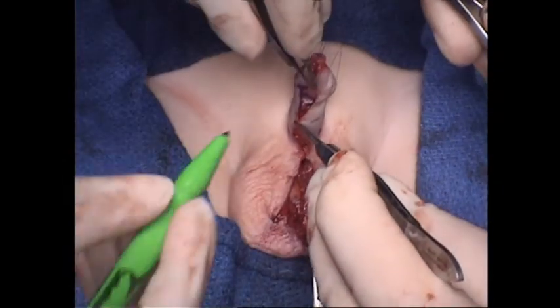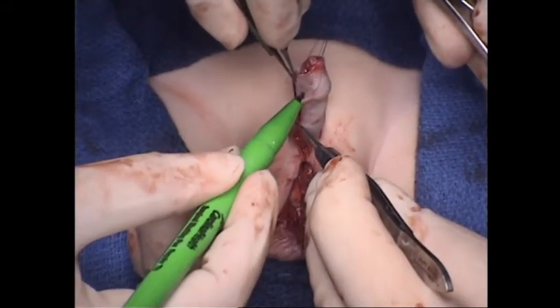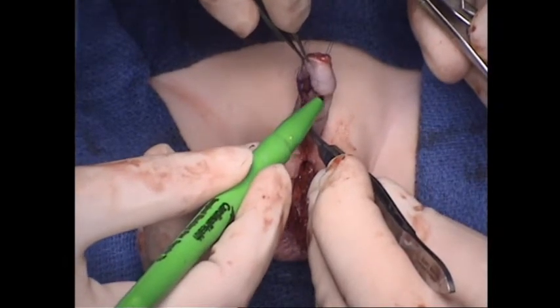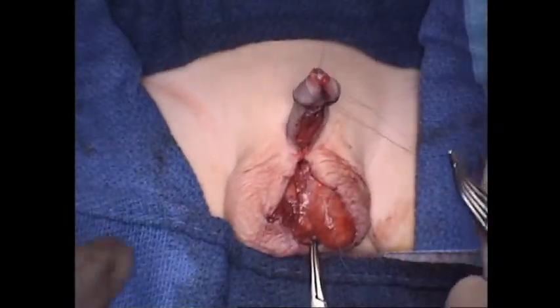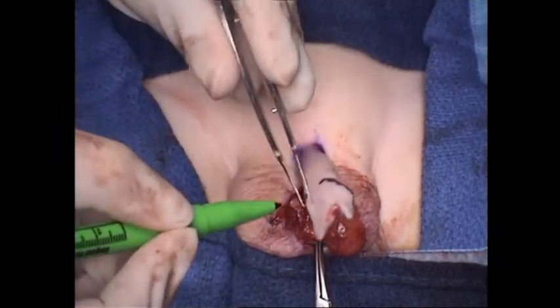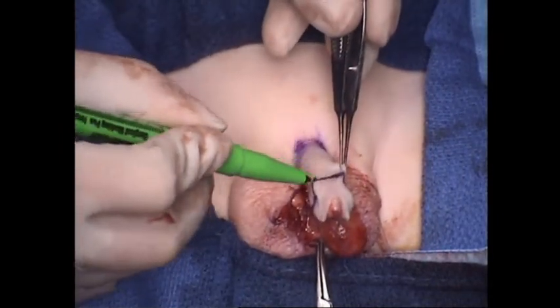And so I'll mark that side first. And since we've got such beautiful retraction here, we'll mark this side next. Again, this can go with our graft because right here is where we're going to want to sew the ventral skin up to the mucosal collar. And we'll mark right along the corona. So now my ventral surface is marked. And so we can come along to the dorsal surface and simply, again, come right along the glans. Relax this a little. Okay, we're not symmetric here.